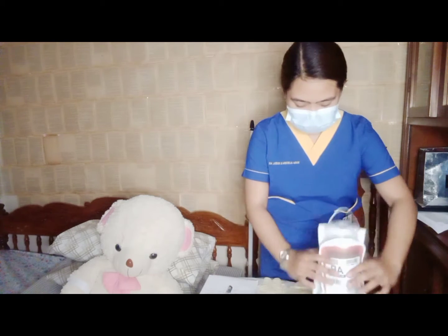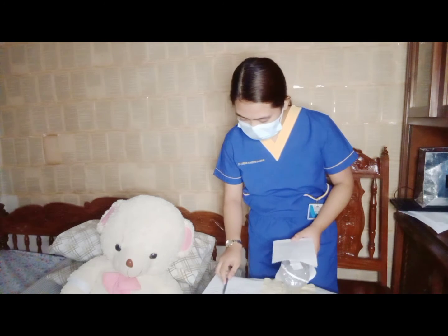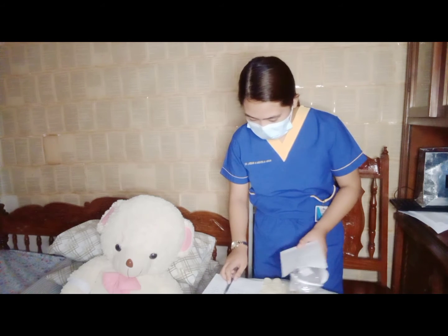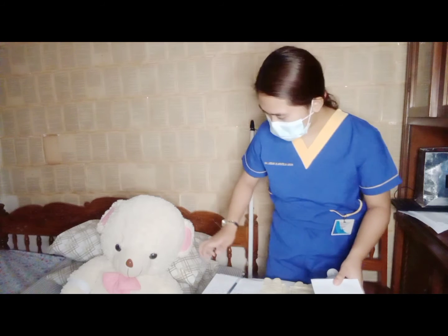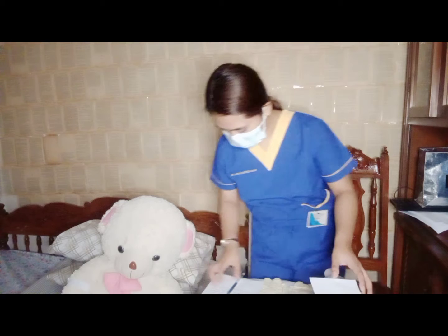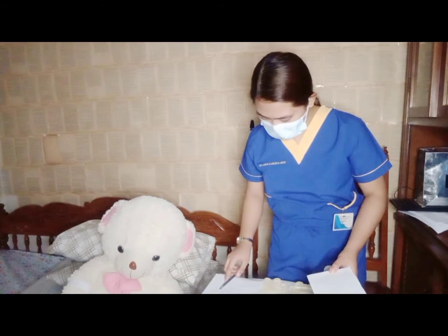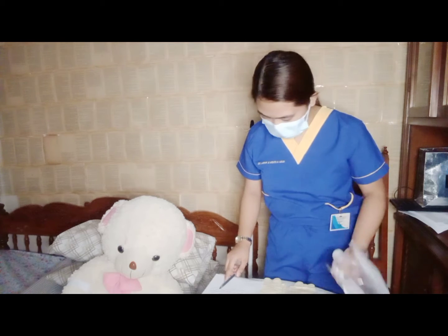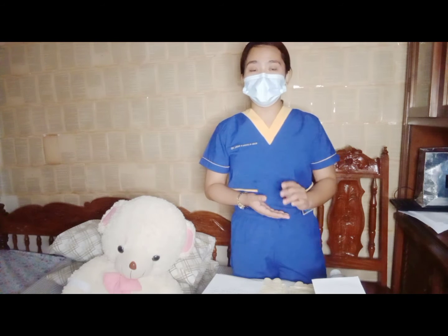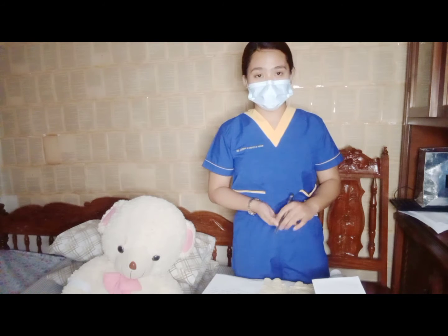Okay, so, medical order for transfusion of blood product, informed consent check, patient identification number. Okay, ma'am, let me check your identification card. Okay, patient name, blood group and type, AB positive. Okay, so expiration date. After 35 days, the red blood cells begin to deteriorate. So, we need to check for the expiration date of the blood product.